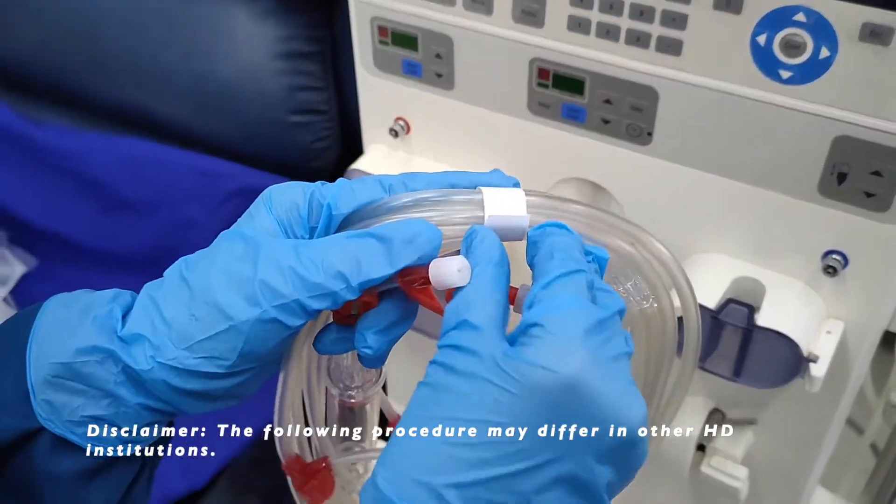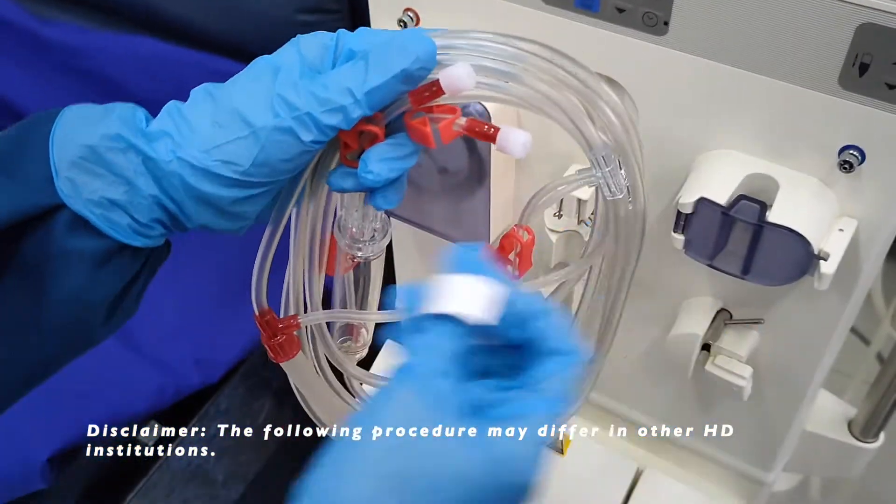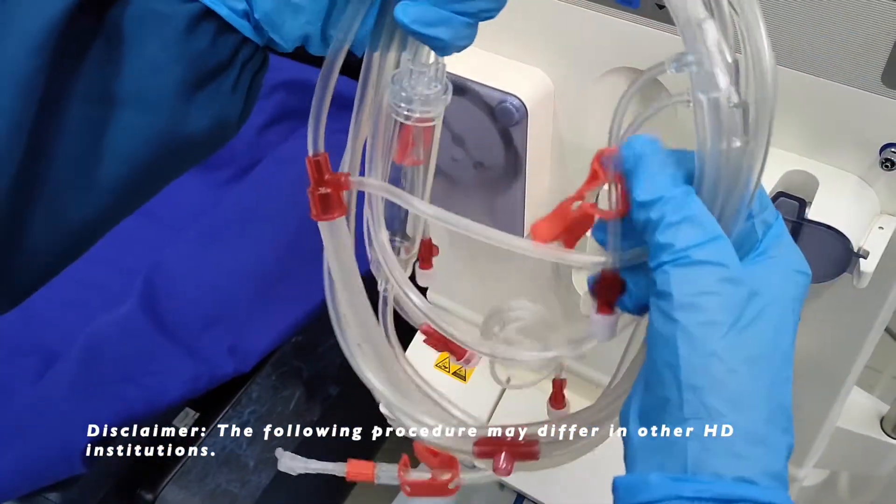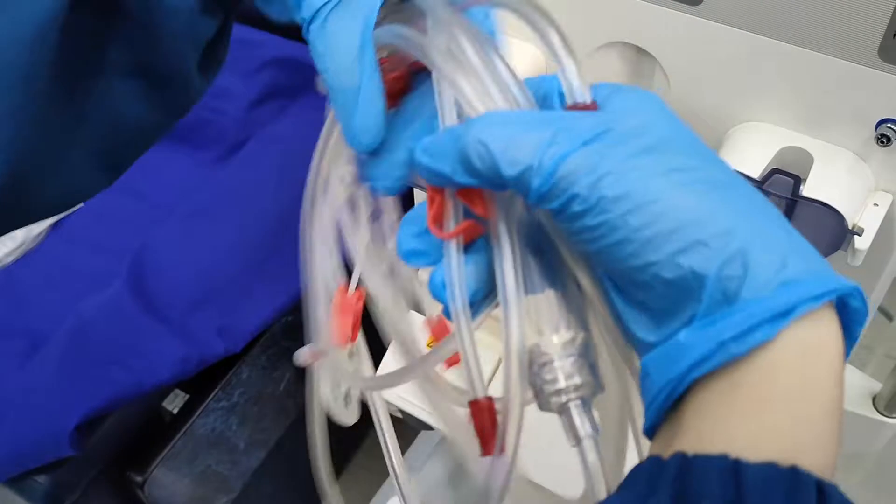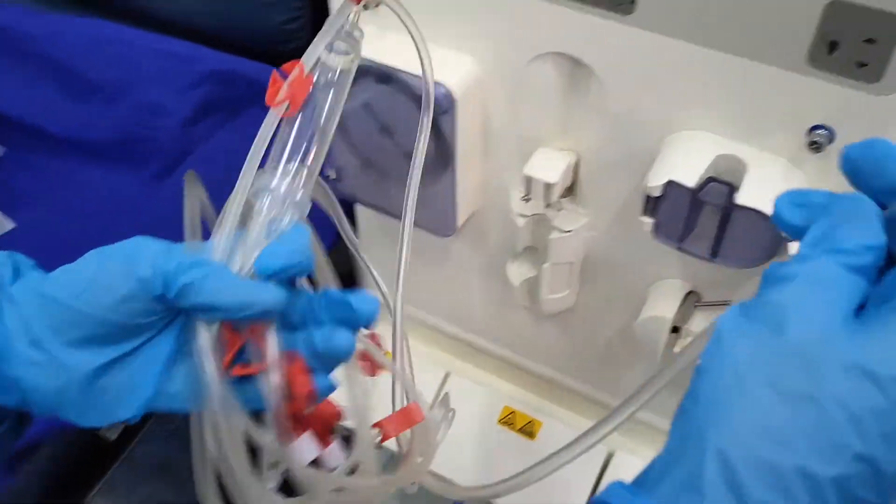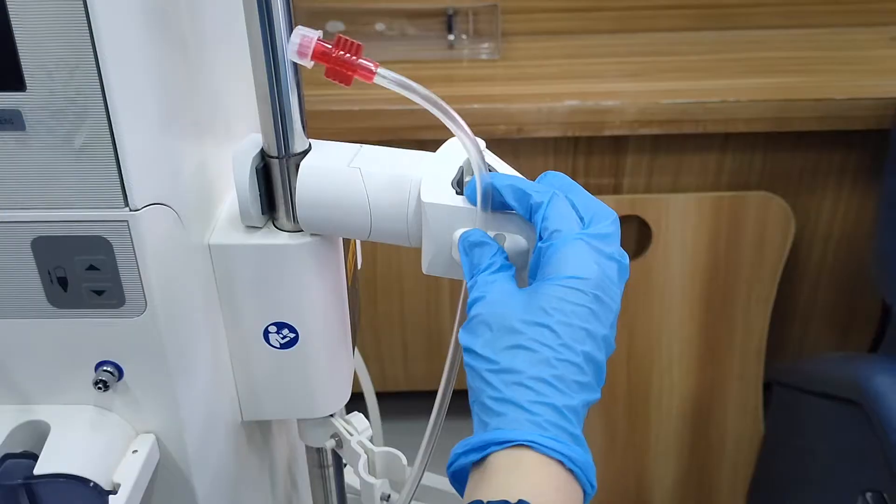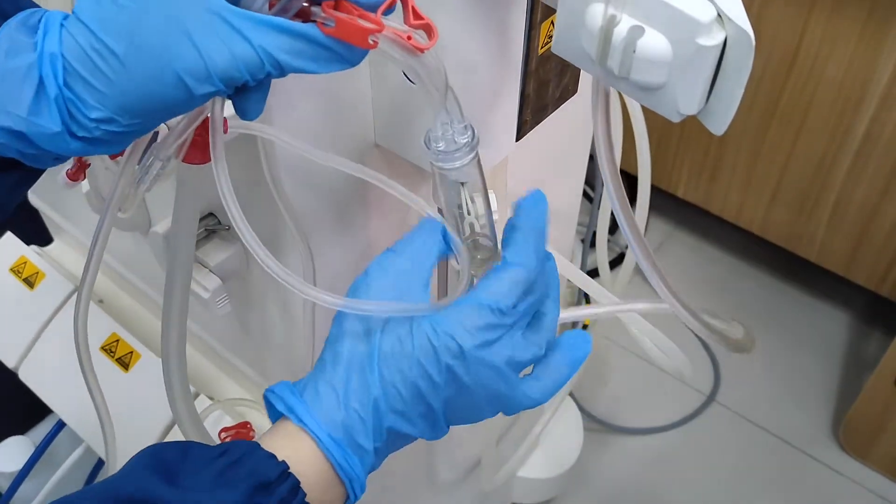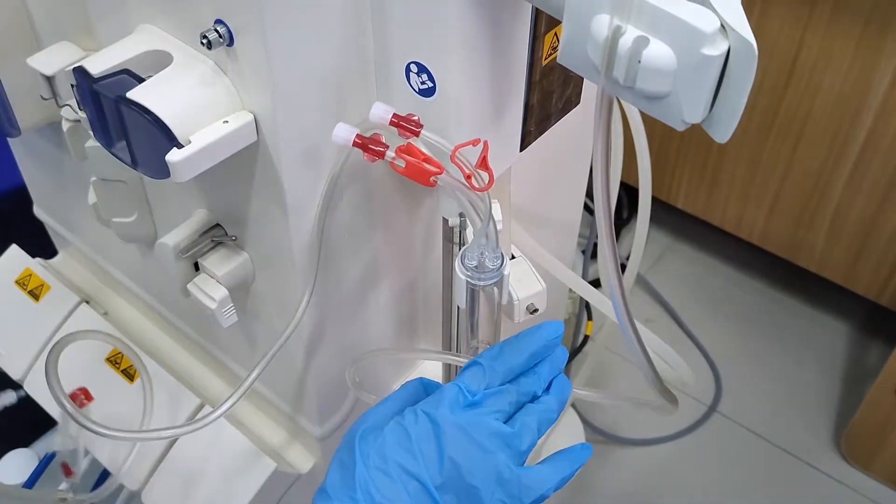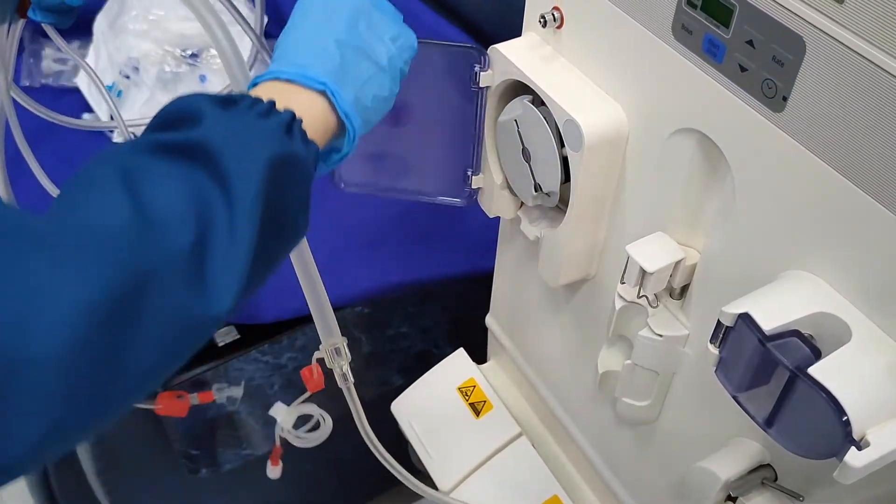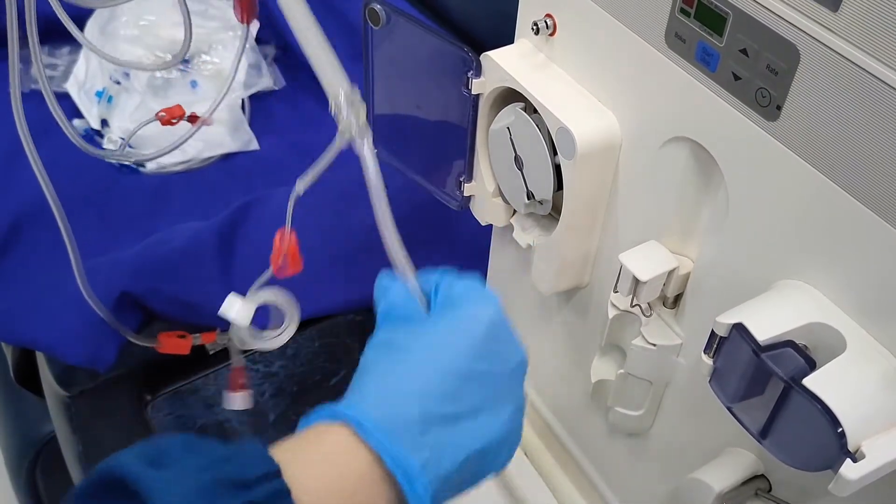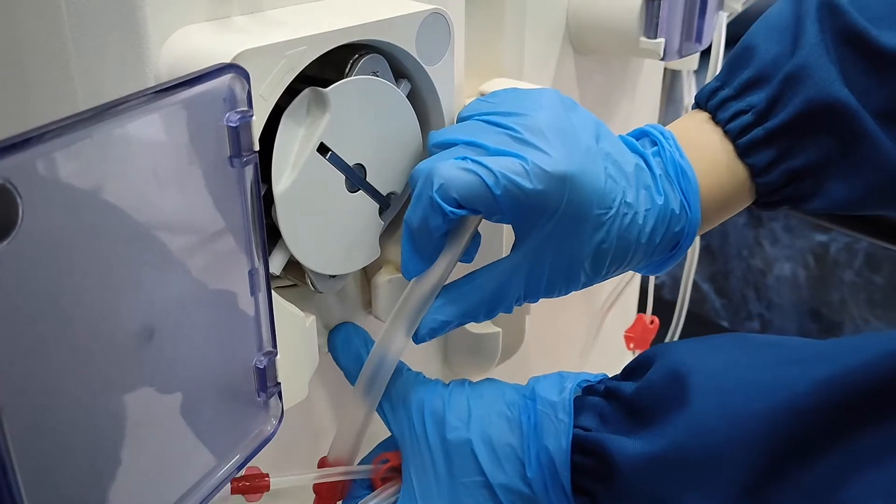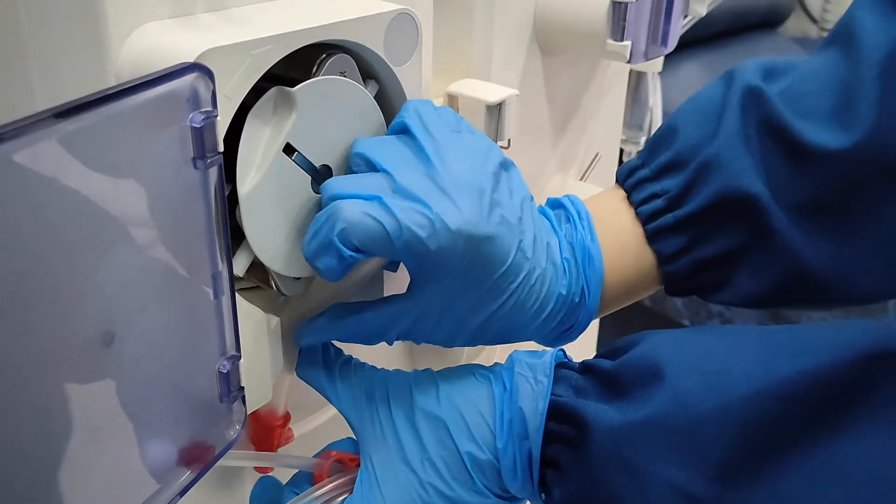In mounting the bloodline, the following procedure may differ in other HD institutions. First, take the arterial bloodline, hang the arterial dialyzer port to a dialyzer holder, then put the arterial chamber in place, open the blood pump, and place or thread the blood pump segment into the blood pump.